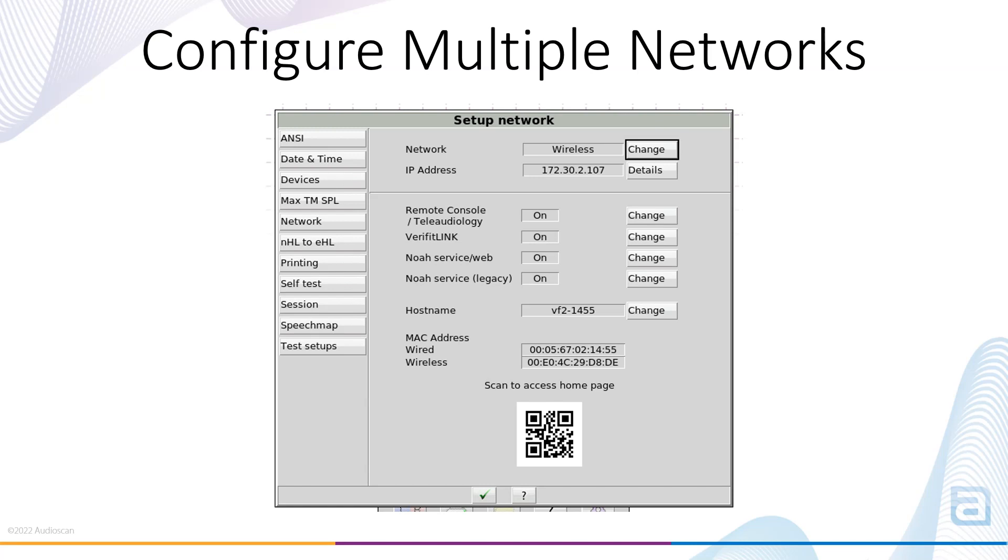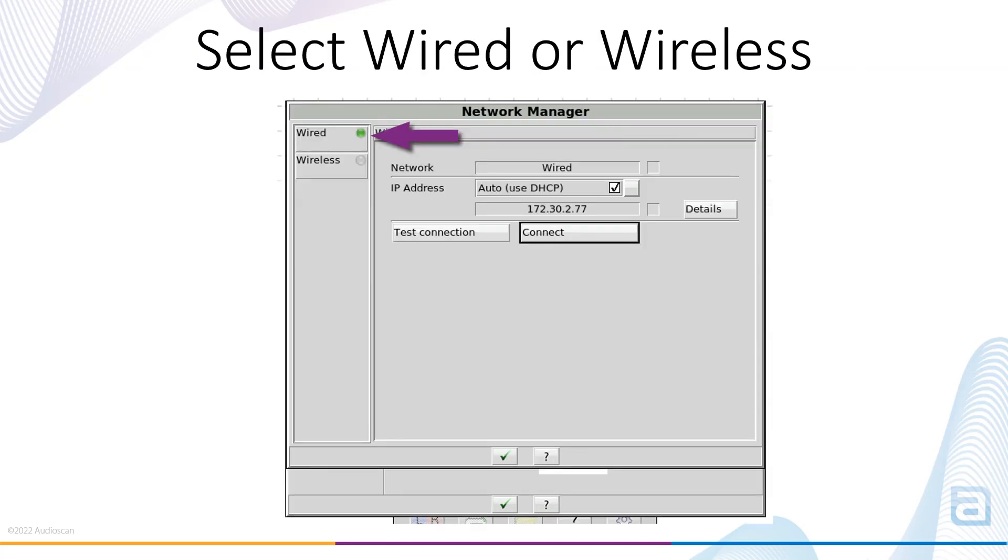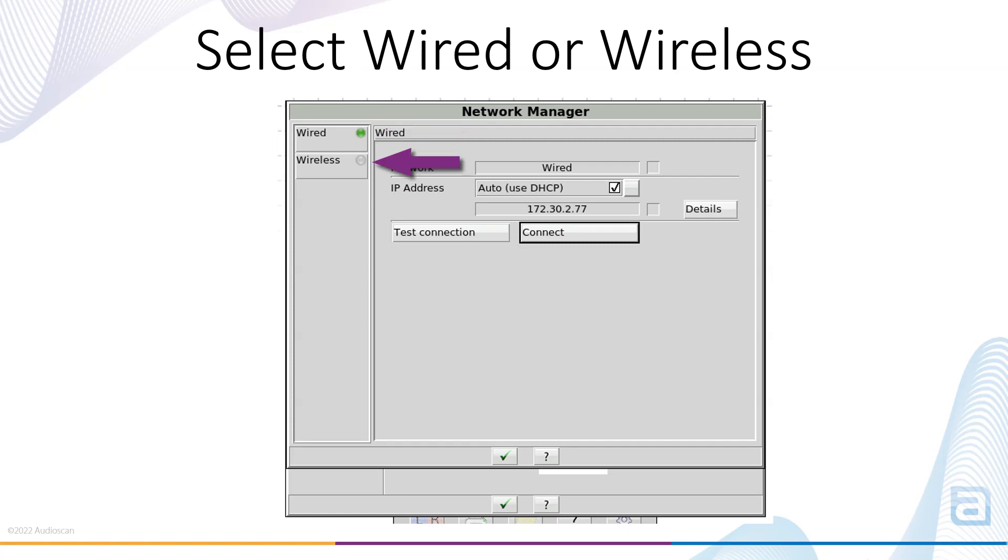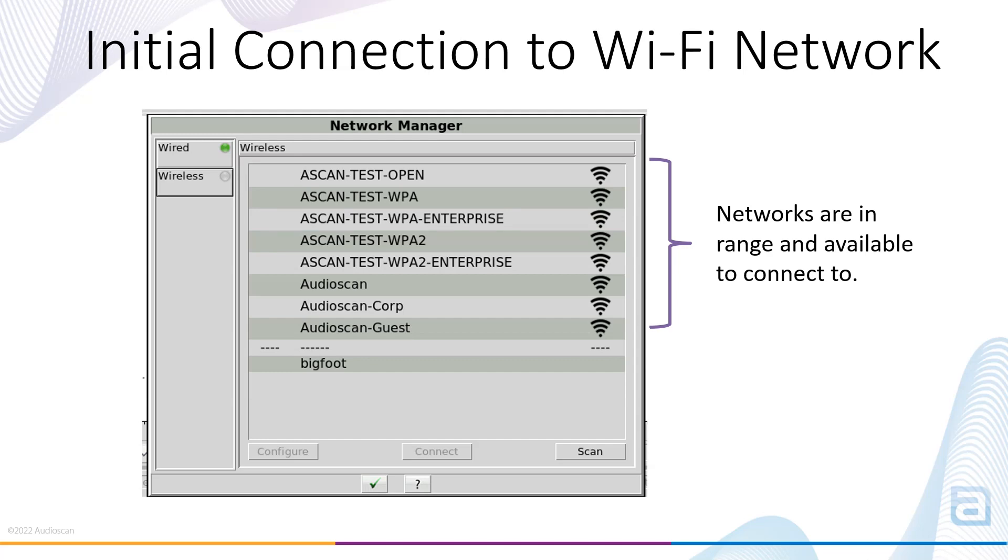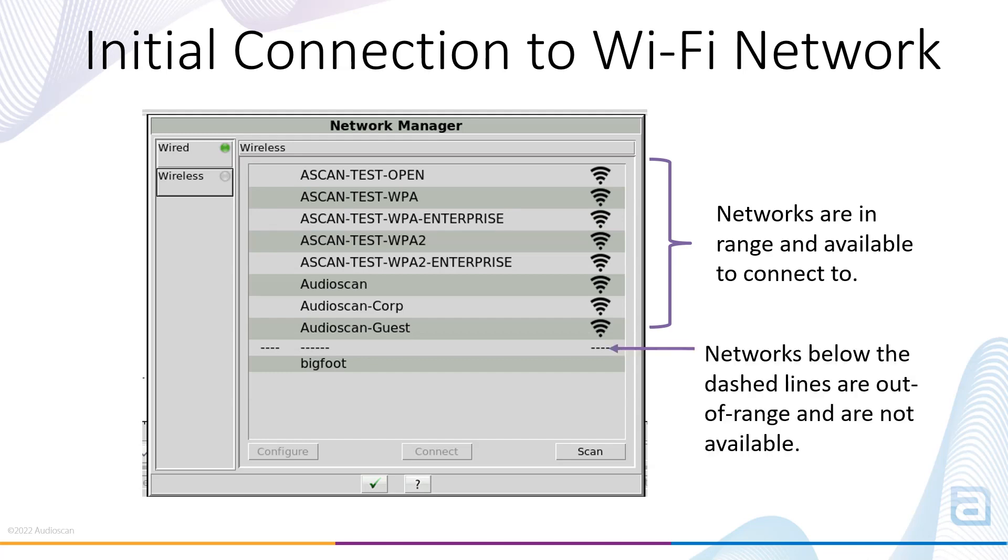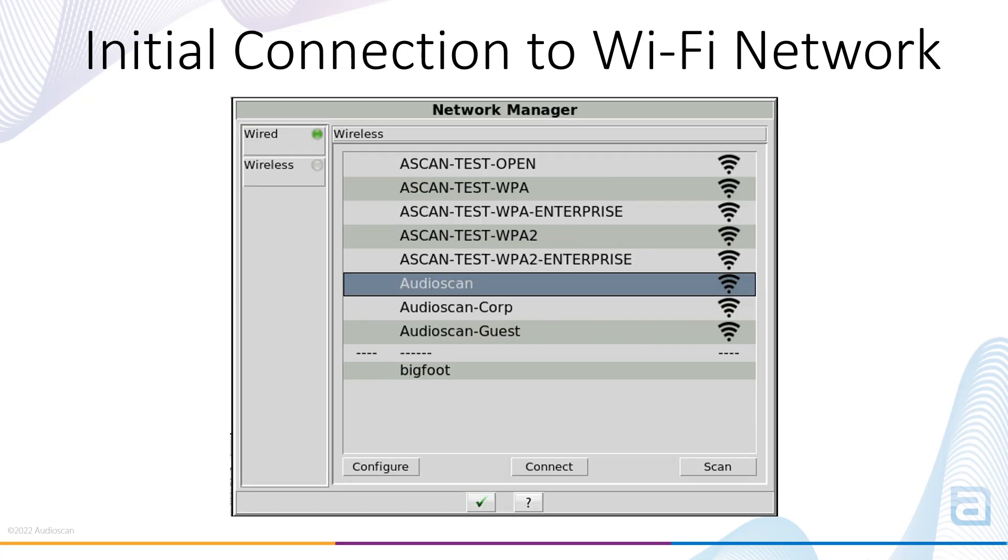To configure multiple networks on the Verifit 2 or Axiom, select the Change button beside the Wired or Wireless selection. First select Wired or Wireless to configure a network. In this instance, the green circle indicates that a wired network is currently connected. When you select Wireless, a quick scan of available networks is done, and a list of available networks appears. If you have previously configured a Wi-Fi network, you can simply select that wireless network, and then select the Connect button to switch to that network.